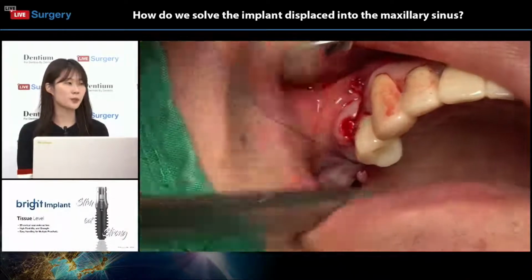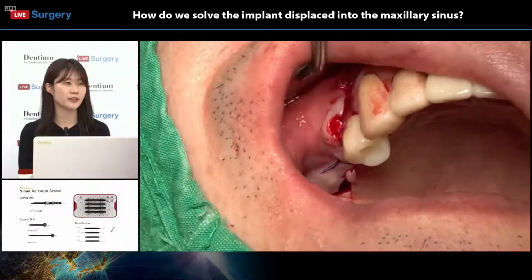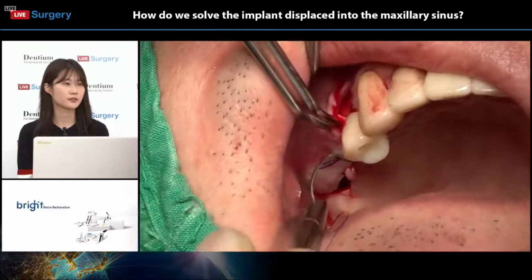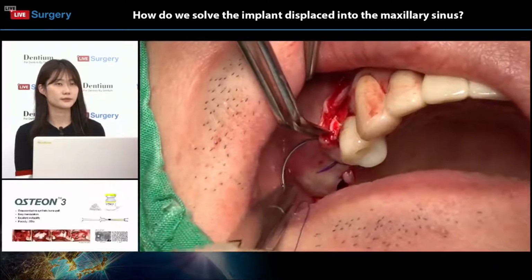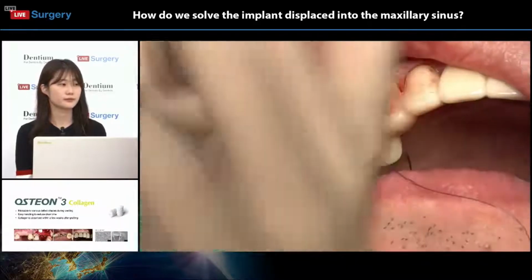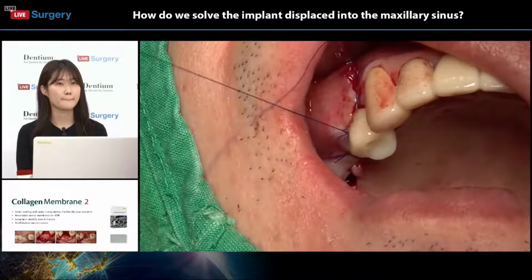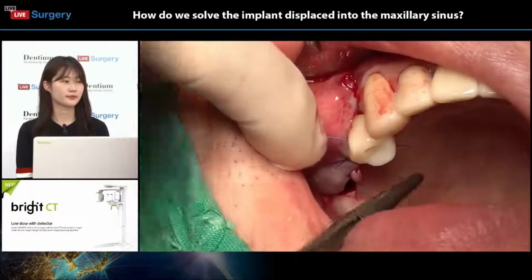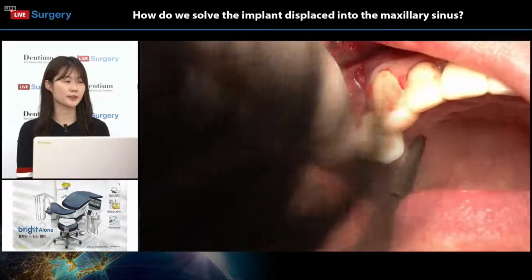It is important that you make key sutures on important sites first and then head to the other area. The suture being used is Dafilon 4-0 to 5-0.